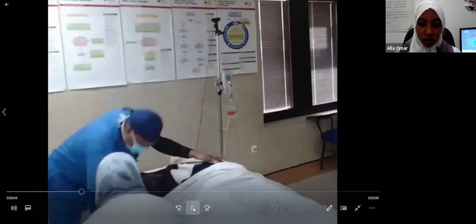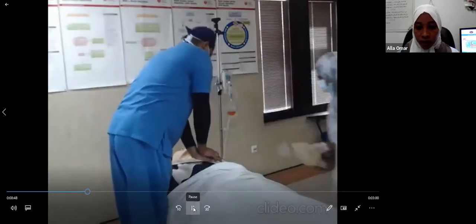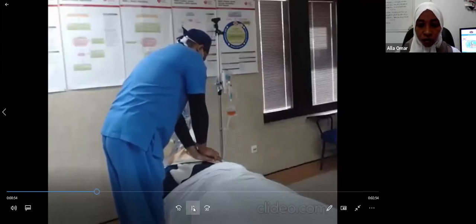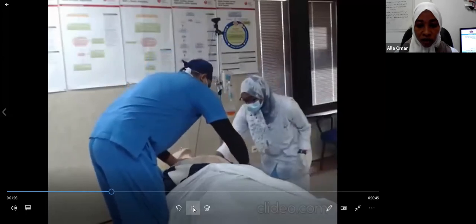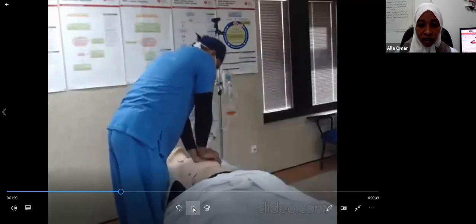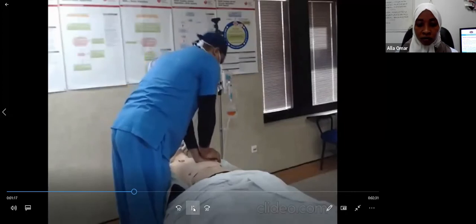But we will see if the second or third nurse comes. What is she going to see? Good. She brought the foot stool to him to allow him to go up a little bit and start high quality CPR. Now, see. Yes, after 30 compressions, she started to give breaths, and she was counting because each breath was supposed to take 1 second. And as I told you, now they are helping each other to attach the code blue cardiac board, and she exposed the chest for the next person to attach the defibrillator pads, and she went to the head part to continue giving breaths.